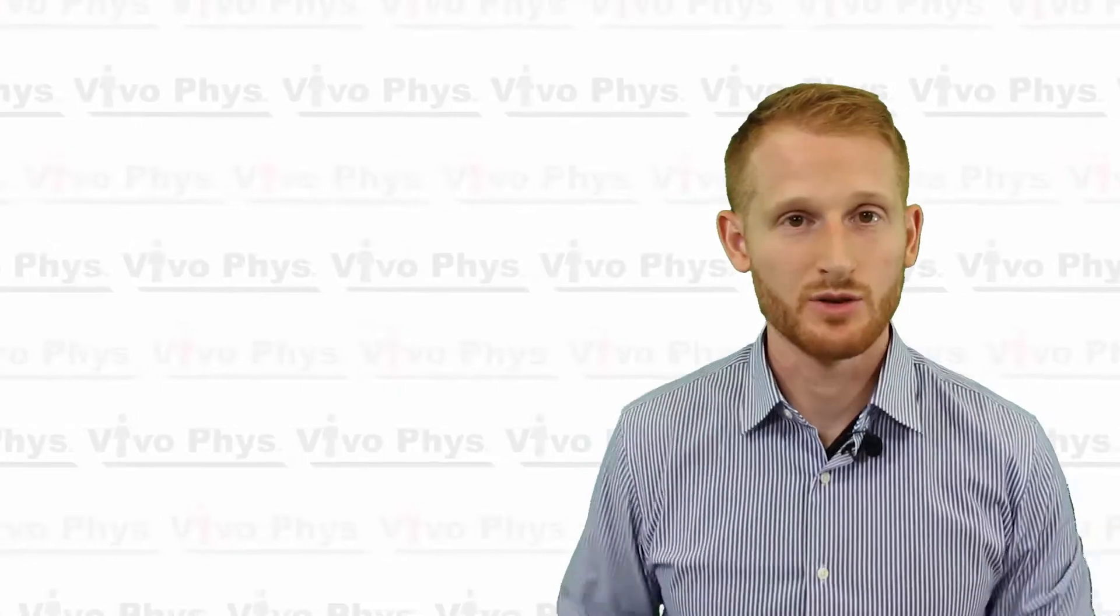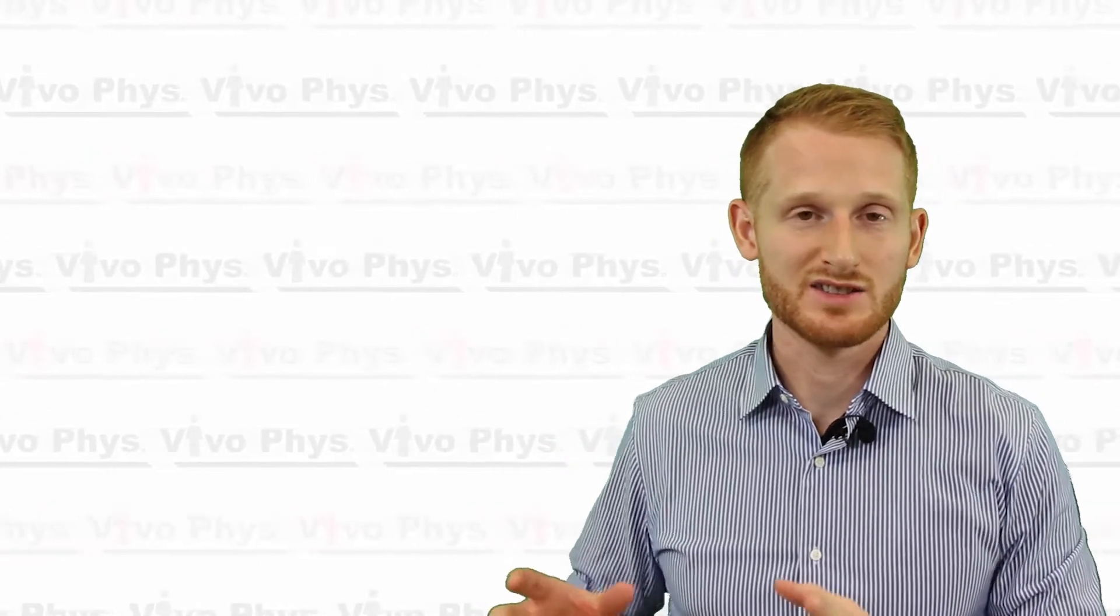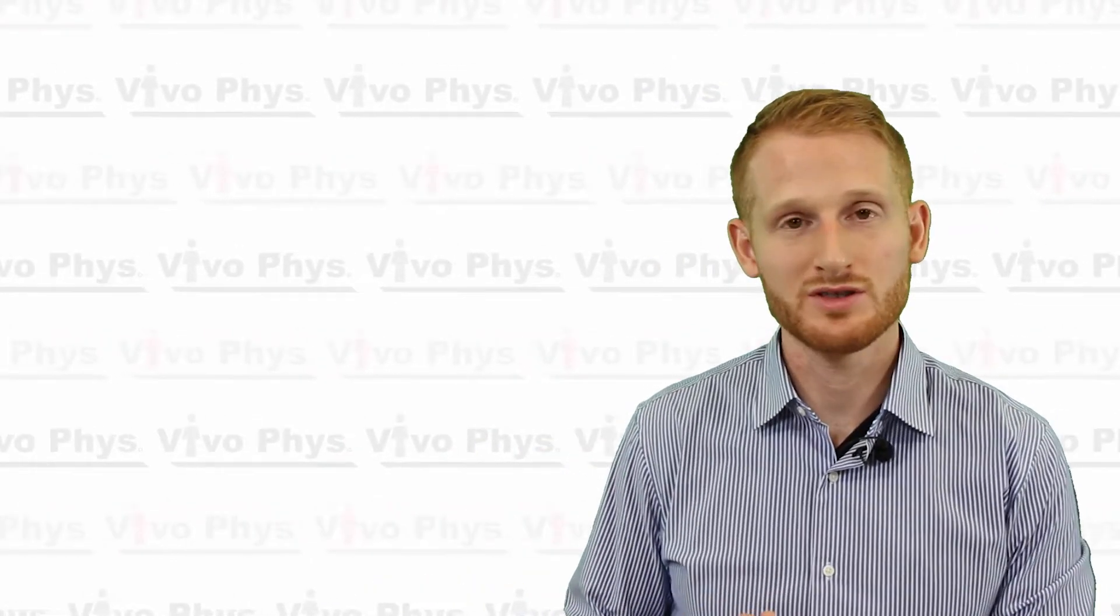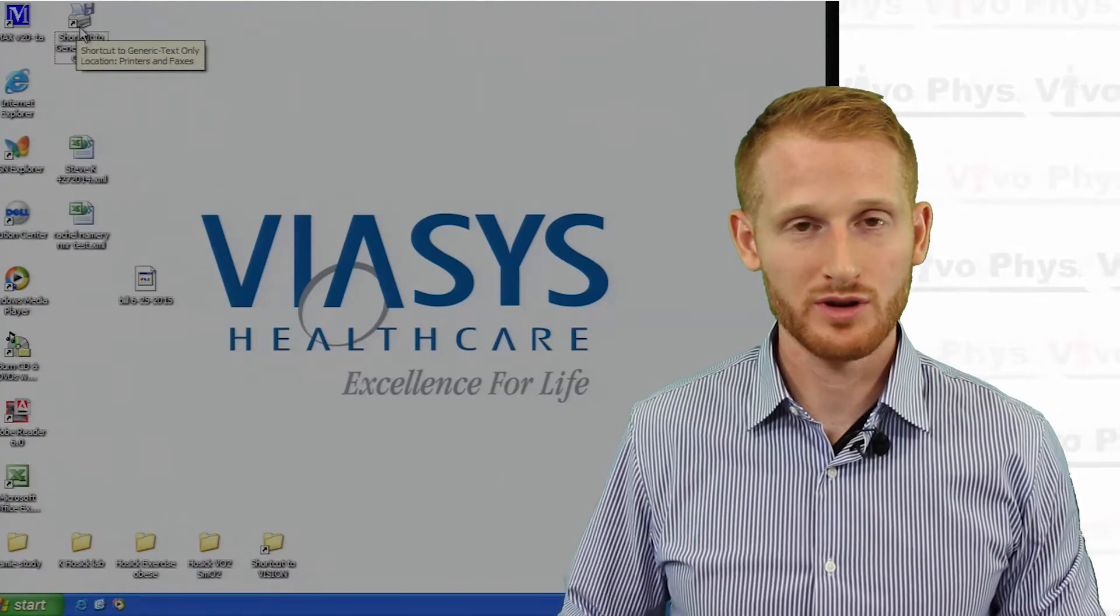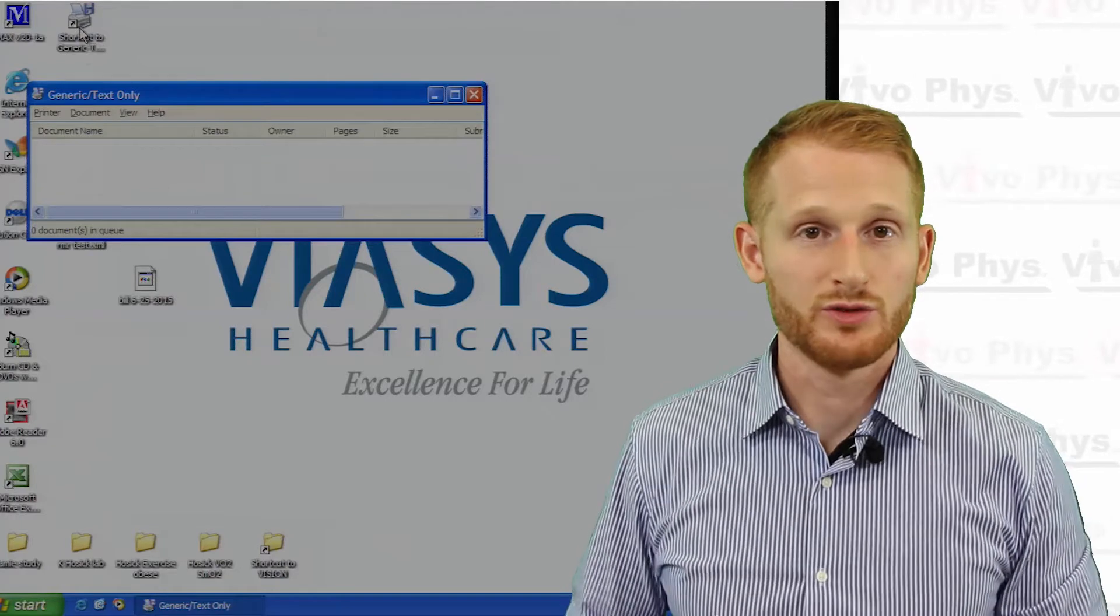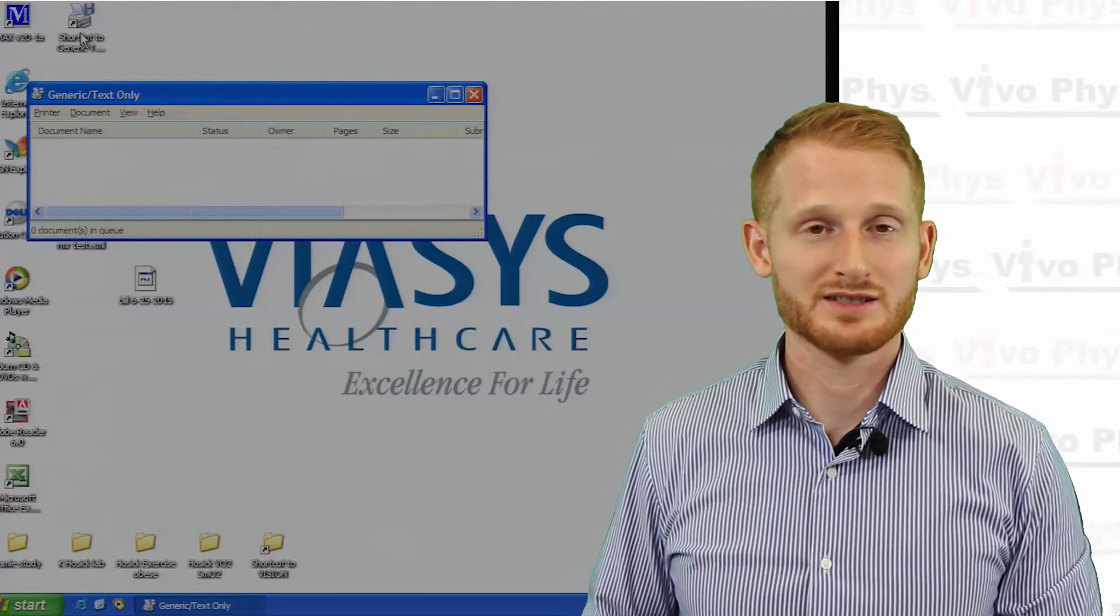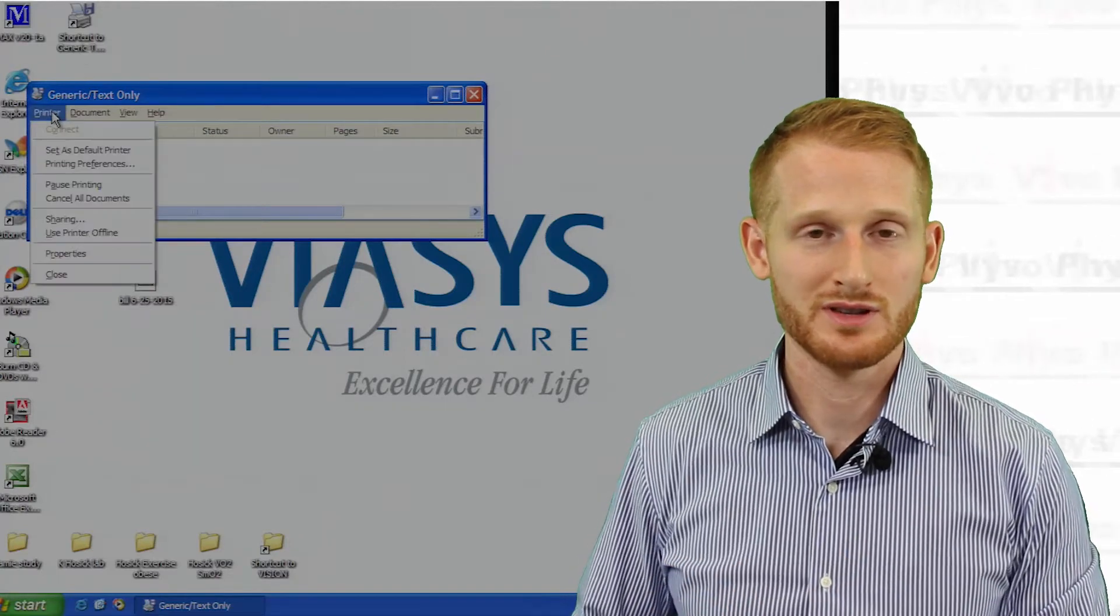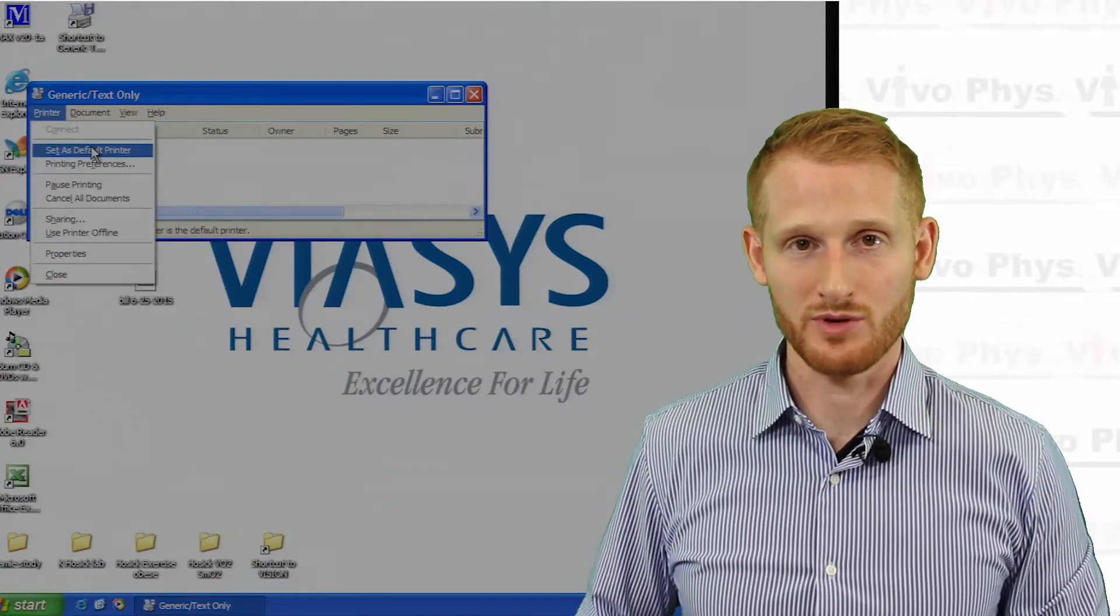If your plan is to export this data into some sort of text file that can be put into something like Excel and analyzed independently of this software, you're going to get back to the desktop of the computer and click on the button that says generic text printer. Once you've clicked on the generic text button on the desktop, go to the printer button and then go to set as default printer. That's going to make it so when you go to print results, it's going to save what would have been printed as a text file.